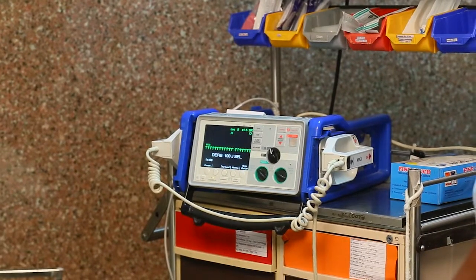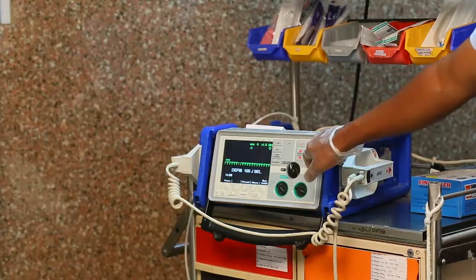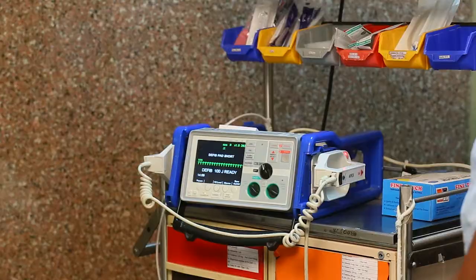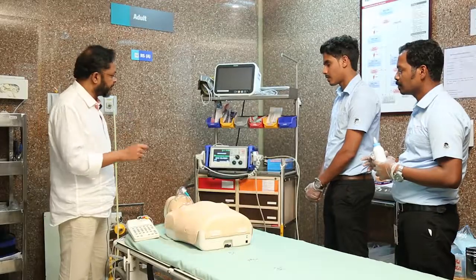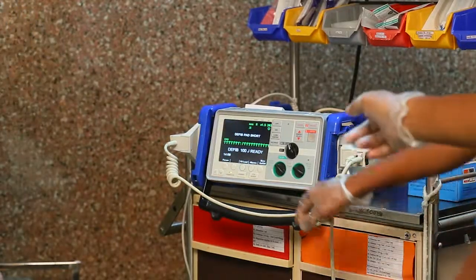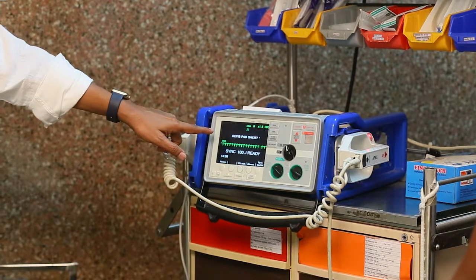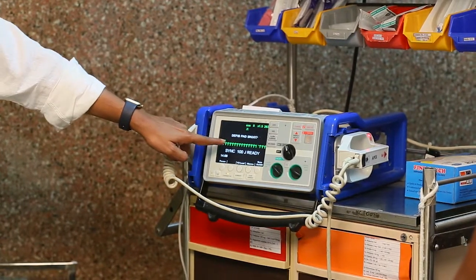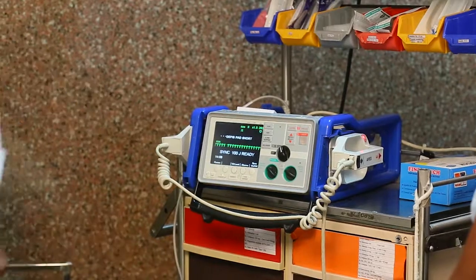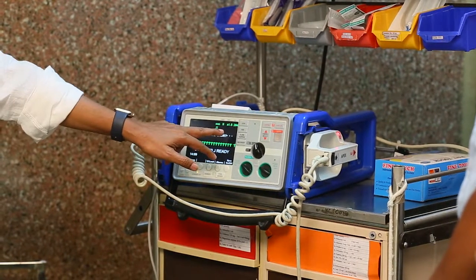The procedure is similar to defibrillation, but we charge first — here charged to 100 joules. Importantly, we must synchronize. Press the synchronize button, and a marker will appear on the ECG trace confirming the machine is now synchronized.